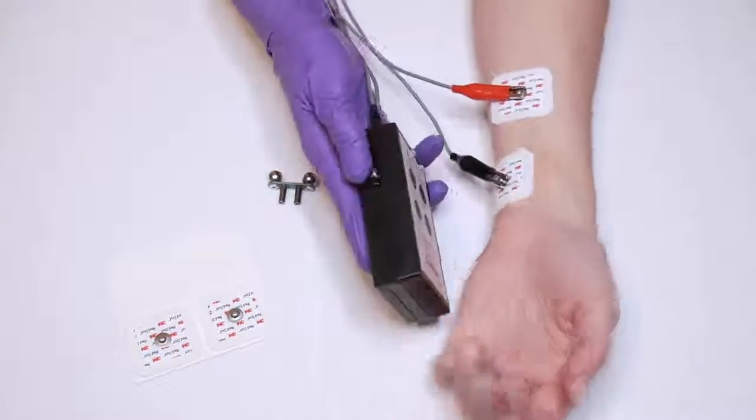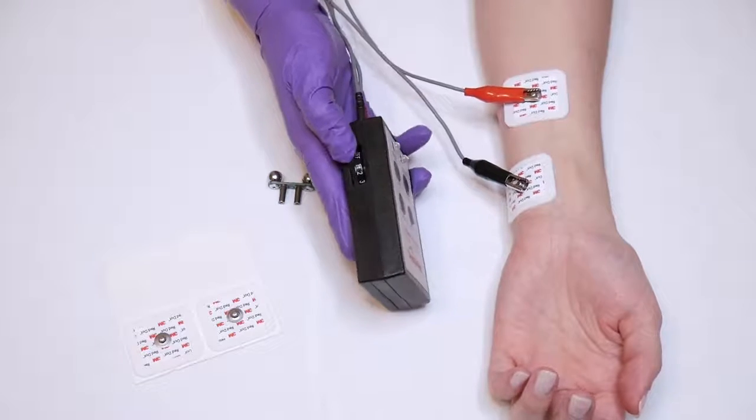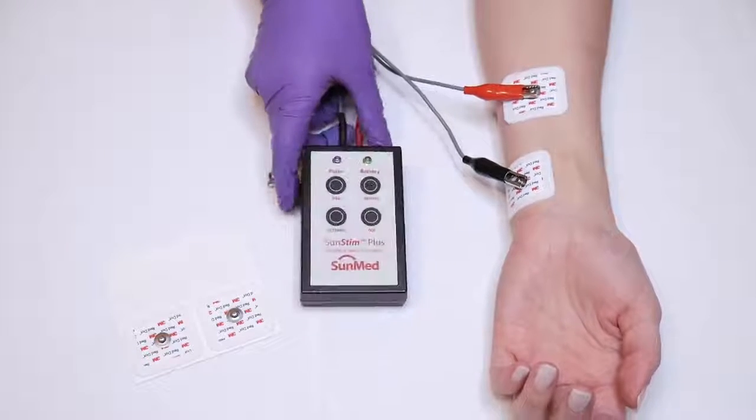When getting the baseline train of four, you will start at one and gradually increase until four out of four contractions are registered.